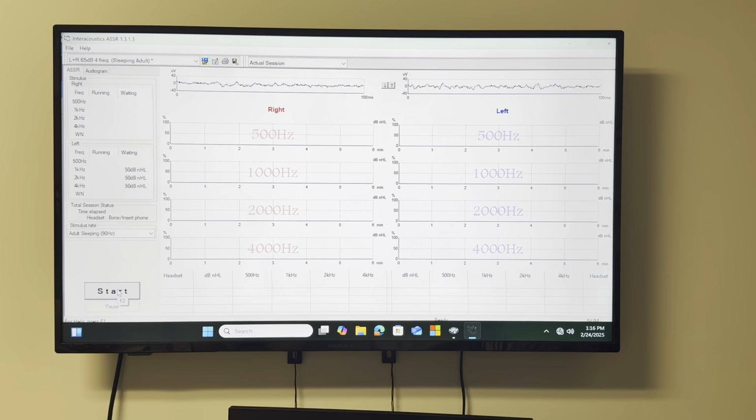I did a little student project. Even if you put the insert in one ear or the other ear, the occlusion effect is the same. So it's one ear or both ears, it doesn't change the amount of occlusion effect. We thought of doing one project where one of the guys would measure some bone conduction, and he told us it doesn't change. We also did some real ear measurement with the probe tube, and it's the same. Start.